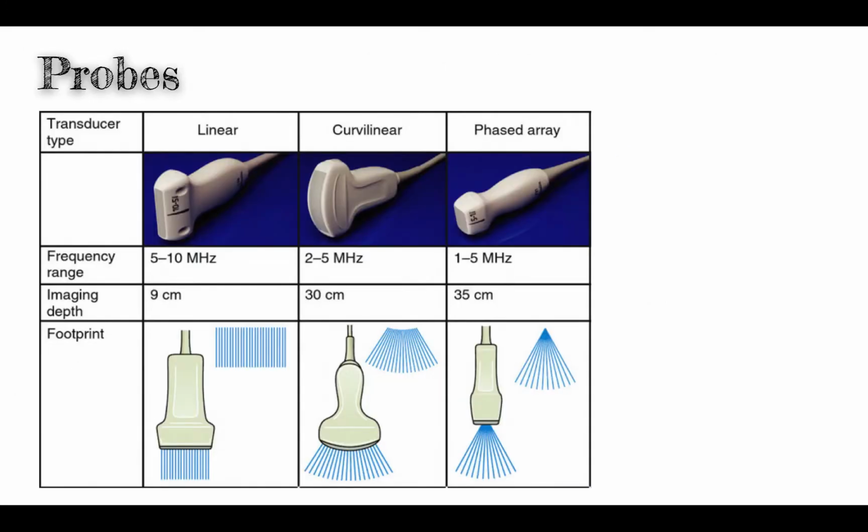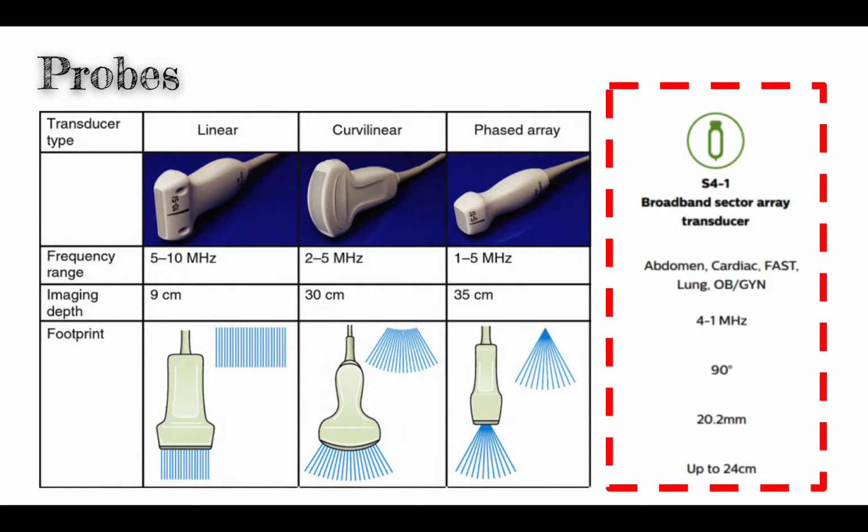There are a number of different kinds of transducers, each with a different frequency range. For MedFlight, we've decided to start by acquiring the phased array transducer, which is more compact and allows for good imaging of the abdomen, heart, and lungs.